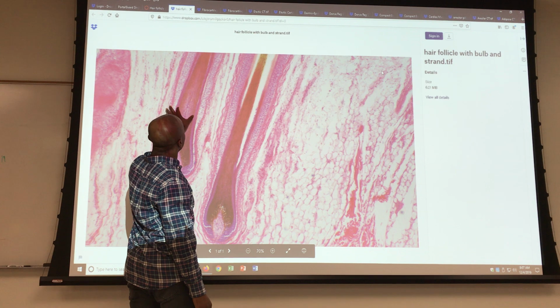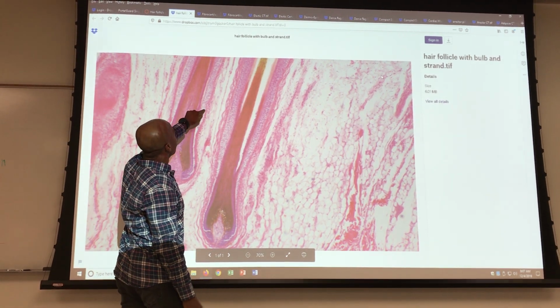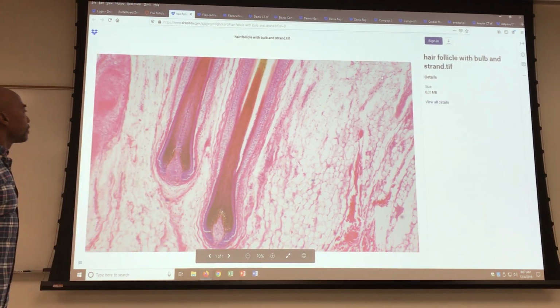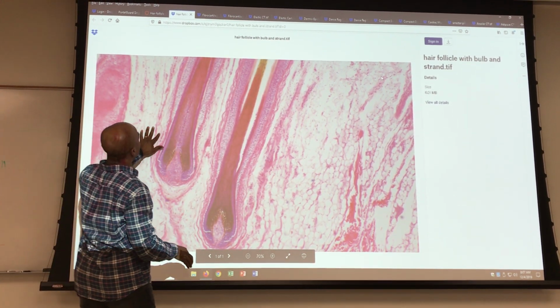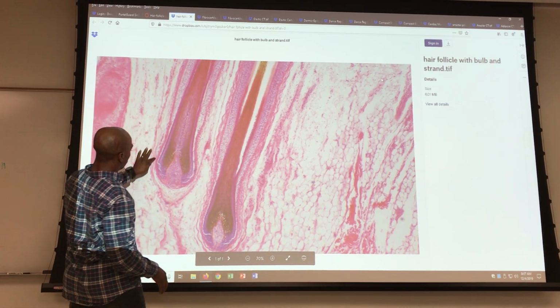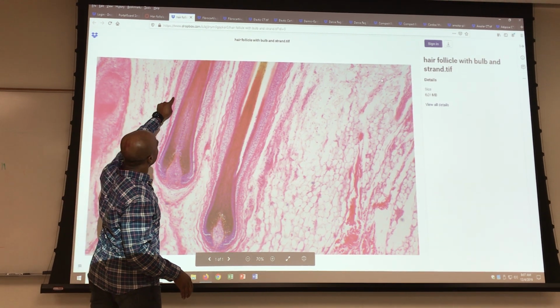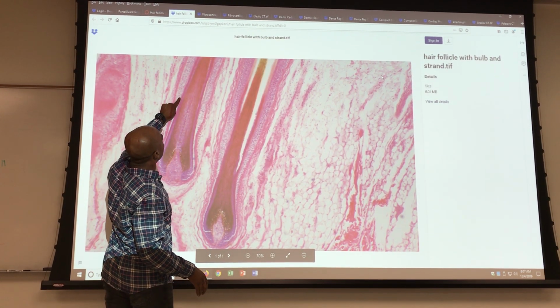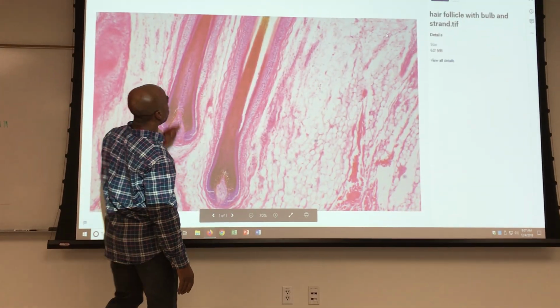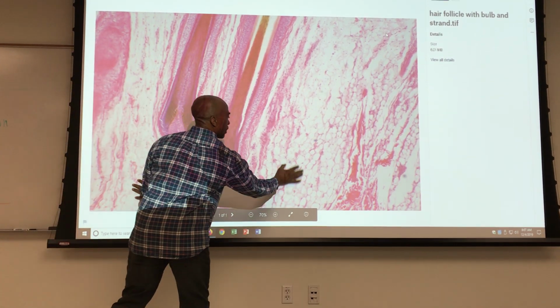And the epithelial root sheath? Root sheaths are these things. They're part of the wall of the follicle. And the connective root sheath? More on the edge out here. But ET and CT. So CT will make this part up. So out here is the CT part. There's the ET part. These two are ET, as outer and inner root sheath. These are fat cells, again, adipocytes.